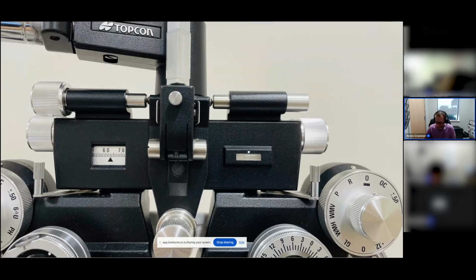There's also a ring around that, a knurled ring around that whole disc. You can turn that, and if you need to put someone's refraction in and need to make big jumps in the spherical part, for instance, maybe they're a -12 or something, rather than having to spin the dial on the side endlessly, you can go in 3 diopter jumps with that, which makes it a little quicker.